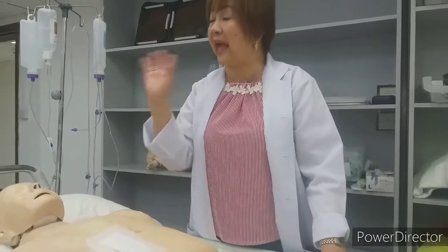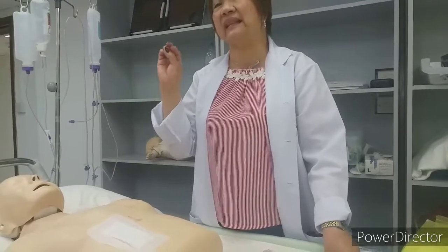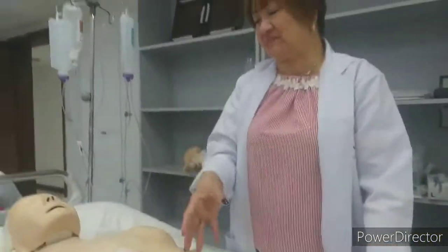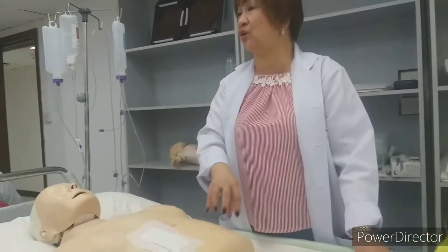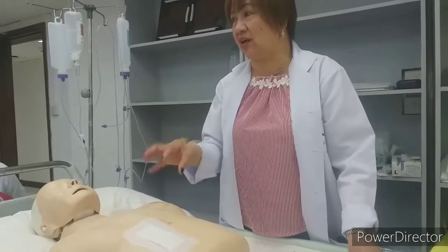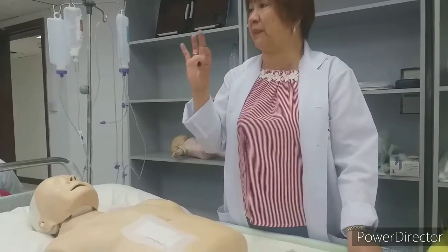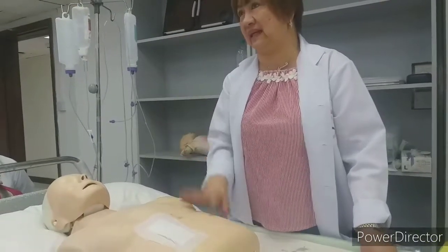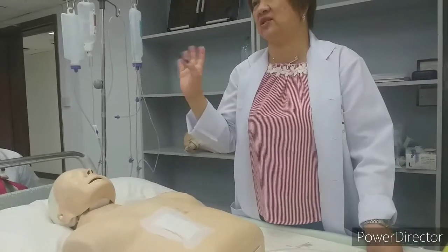If it is pink, it means fresh, good-looking intestine. If it is already pale, pale is no good. So you should see if it is pinkish, which means that is a good colon. Pink is healthy, the other is not.